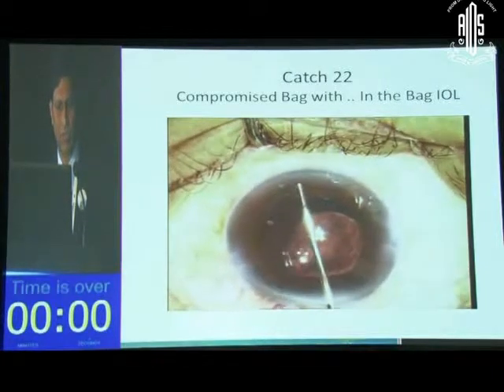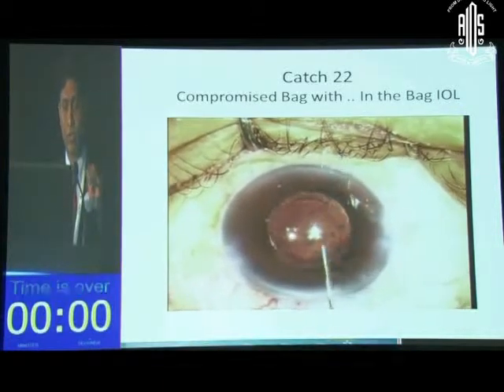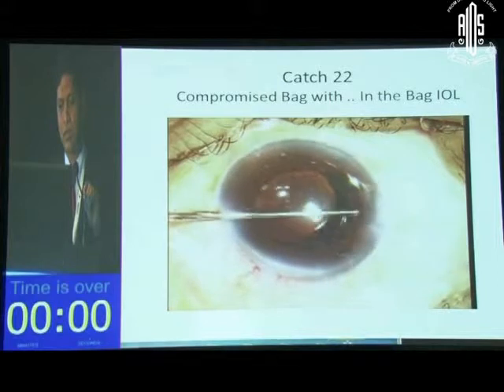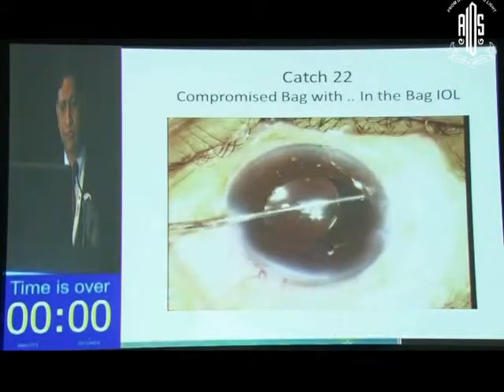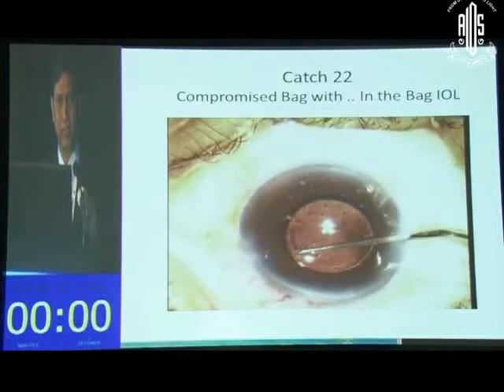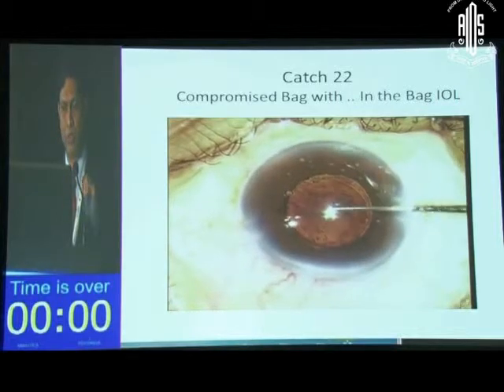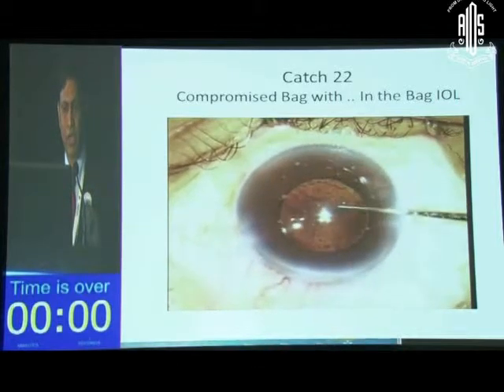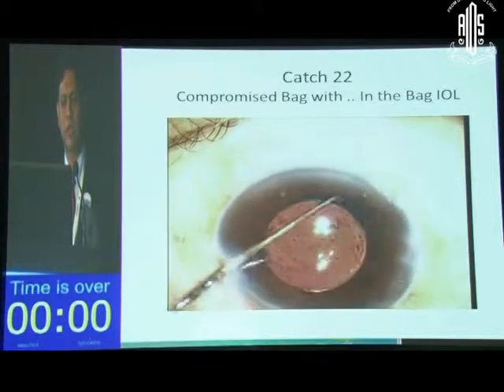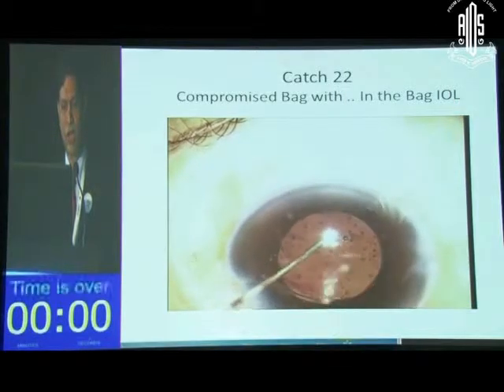Now this is a bit controversial, but there is a lot of literature coming up now. I'm not going to leave it in the sulcus like that. I am stupid, but probably not that stupid. So the haptics go into the sulcus. All the issues of leaving a lens in the sulcus are because the lens moves against the iris. If I could do an optic capture in the capsular rhexis, that lens would not move and there would be no chafing. So I went ahead and did that optic capture, and the proof lies in seeing a fusiform capsular rhexis, which suggests that you have done a good optic capture.